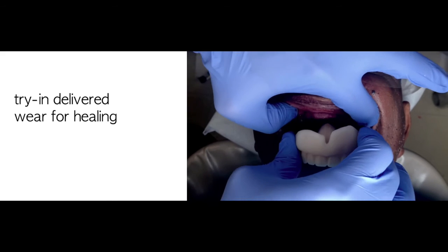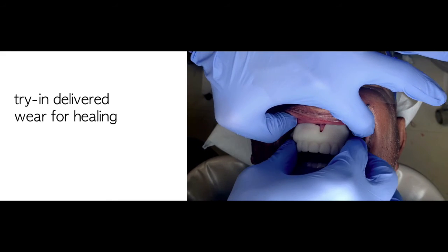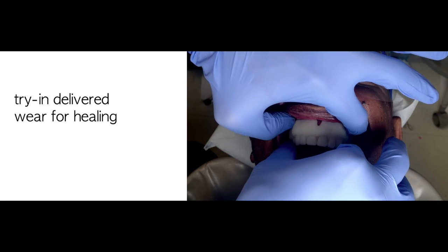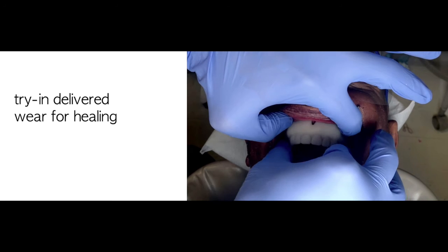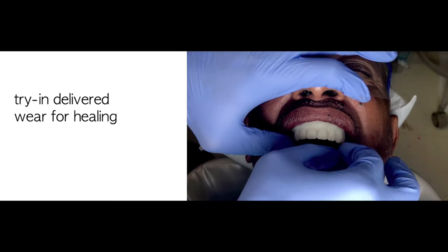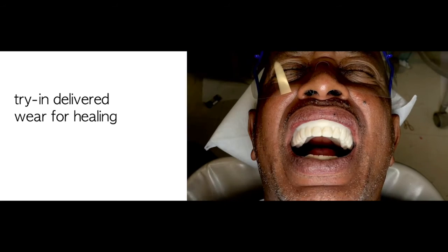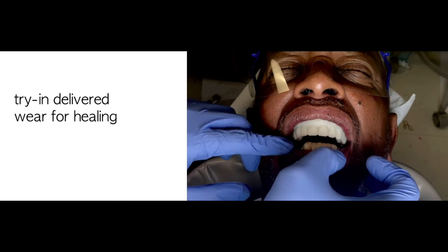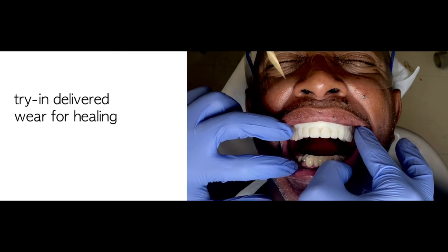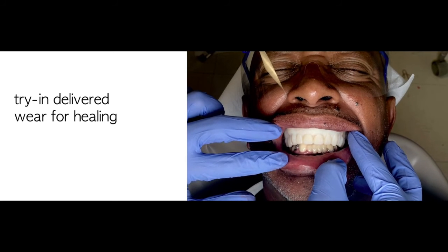Now we are going to deliver this try-in, and patient will wear this try-in denture for about a month for tissue healing. So this is delivery of the try-in denture, and we are checking the bite.